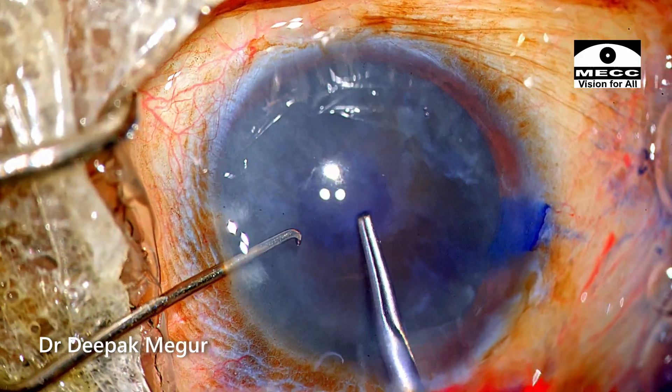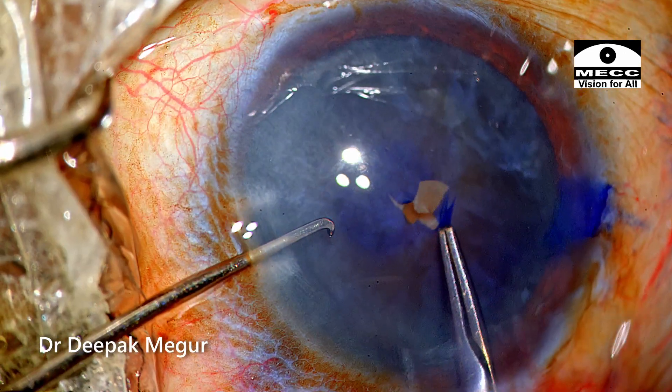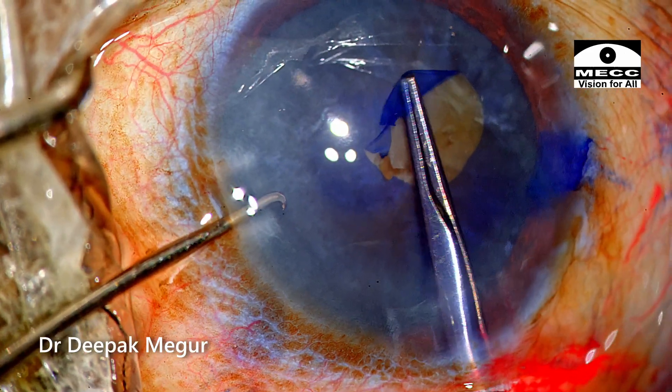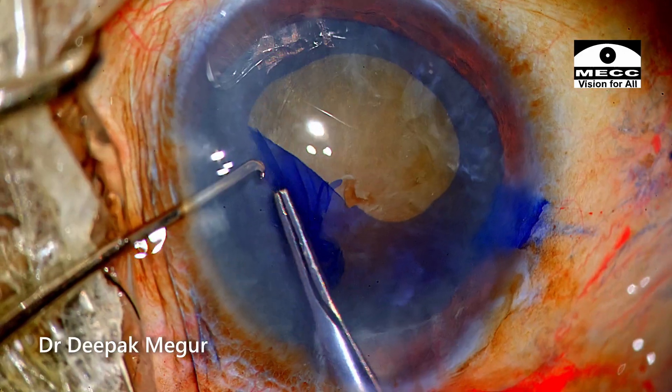I'm really worried about how the zonular health will be, and very anxious to know how the capsule behaves once I puncture it. Thankfully, it looks like the zonules are quite healthy, and the rhexis could be done very easily.